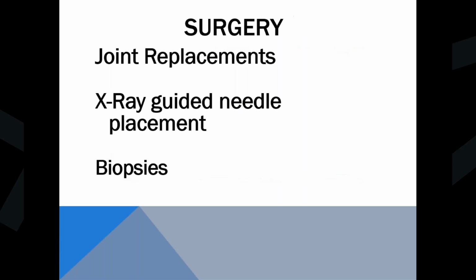Some of the areas that you'll see they'll use fluoroscopy in surgery is joint replacements. So if they're replacing someone's knees, doing a total knee replacement, or a new hip, they'll want to test it and make sure that it works okay and it doesn't jam or have any obstructions before they send them out.